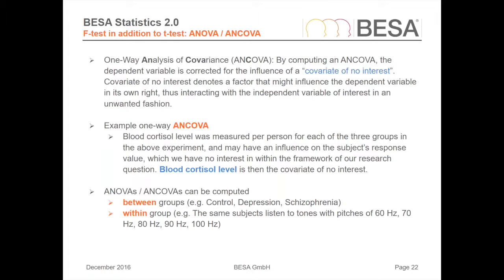Yeah, and the ANOVAs and ANCOVAs can be computed either between groups, so this is the example that we just talked about, or within a group. For example, the same subjects listen to tones with different pitches or different intensities.